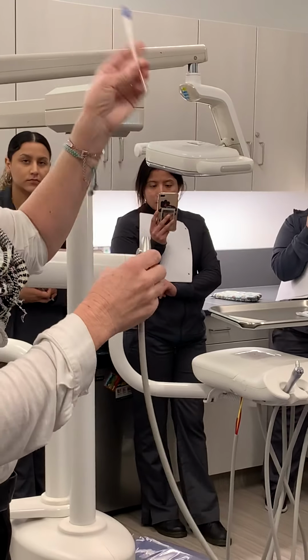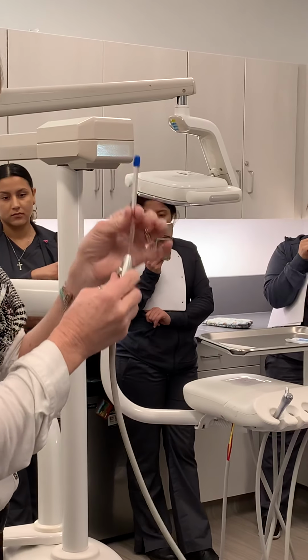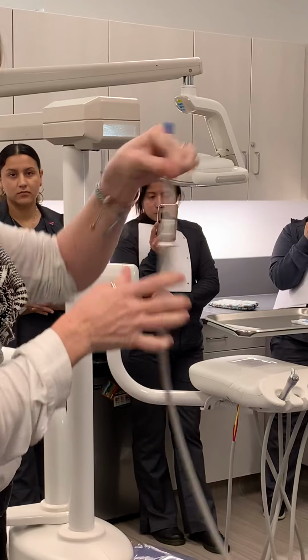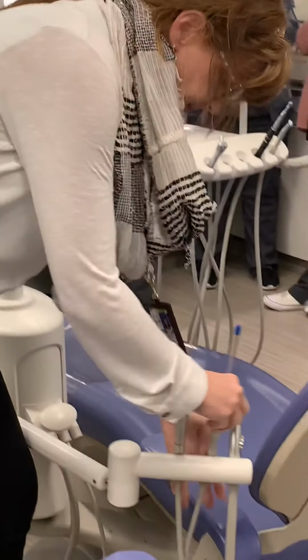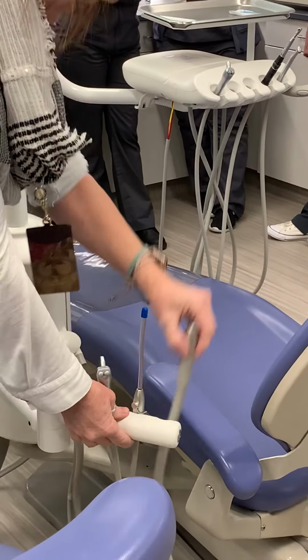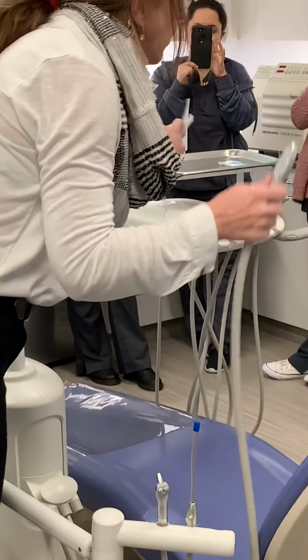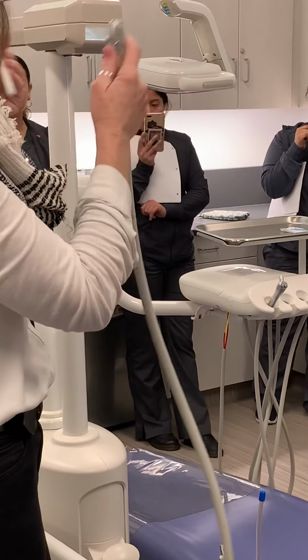This is disposable, one-time use. It picks up water, blood, and saliva. Okay, we always put it in and we always wiggle to make sure it will stay. Okay. Nothing worse than it falling out when you're working chairside. Next, we have the HVE or high vac or suction. I just call it suction.